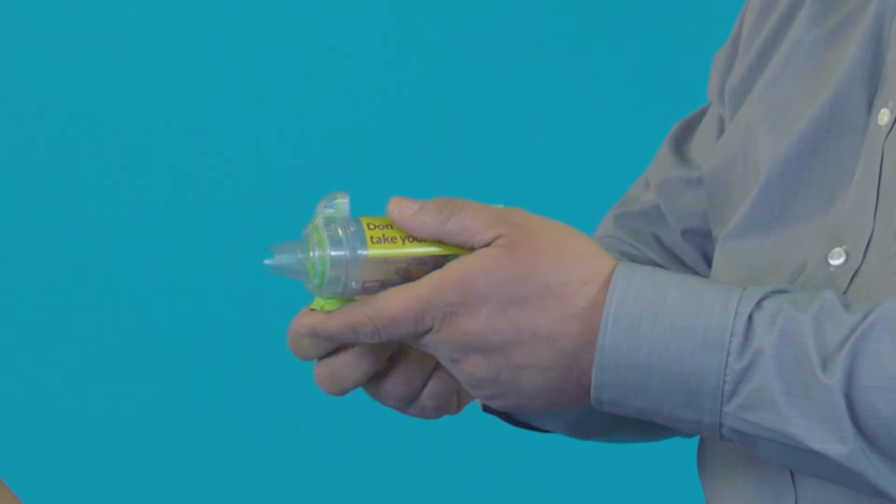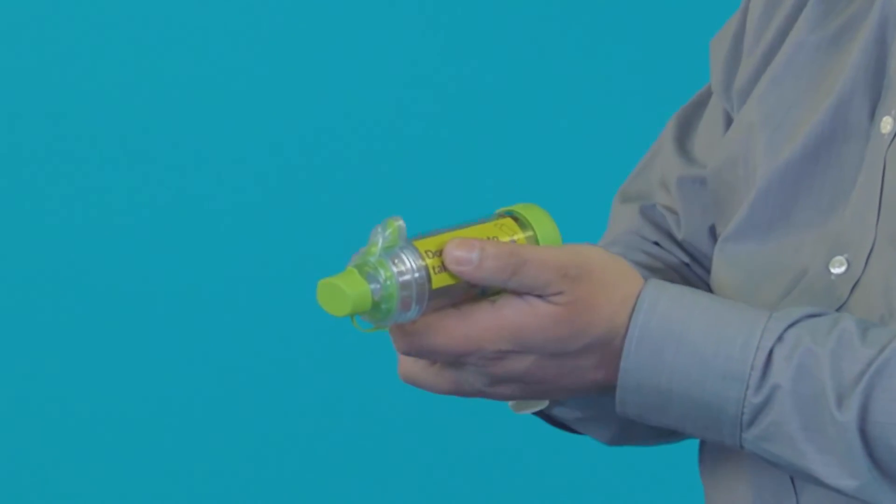When you finish, take the inhaler out of the spacer and replace the caps on the inhaler and the spacer.